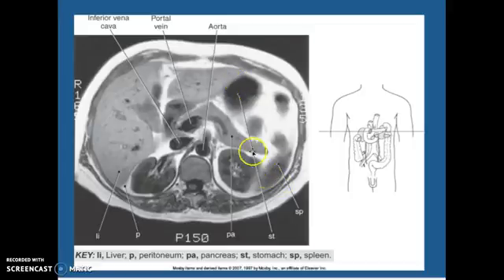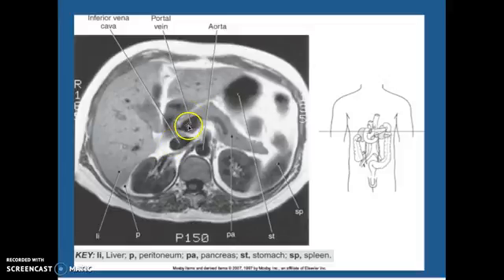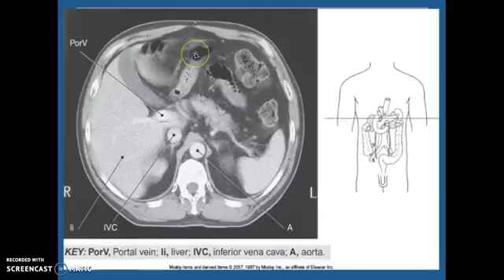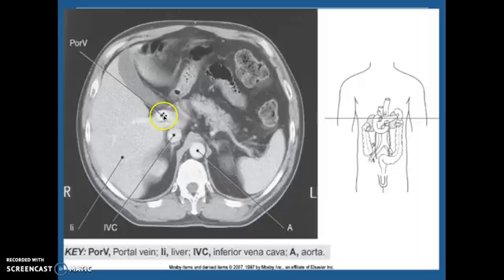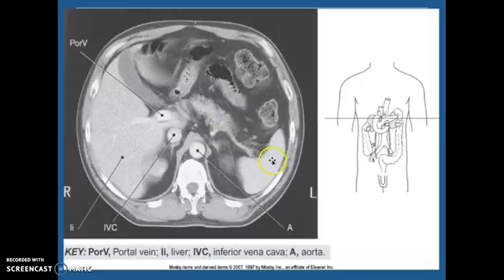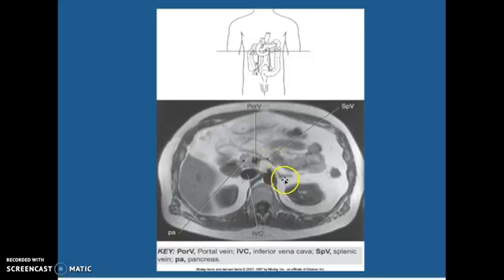Your stomach, spleen, left kidney, pancreas is right here. This is your aorta, inferior vena cava, and your portal vein. Your liver comes across here. So aorta, inferior vena cava, and your portal vein. This is your gallbladder right there. This is your spleen, your pancreas. Portal vein is right there — aorta, IVC, portal vein. This is the head of your pancreas.